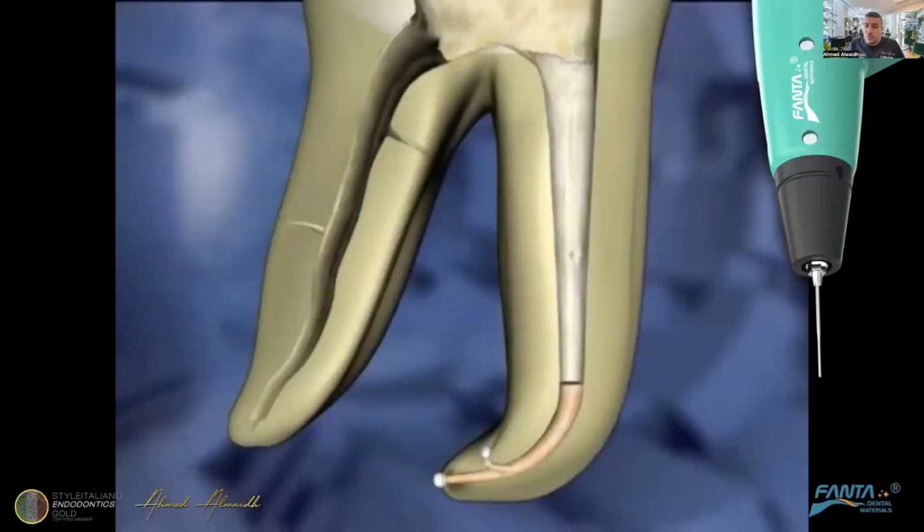Now, how are we going to use this one? Again, we will finish the obturation. We're going to put the device, the tip. The tip should reach the level where we start. And we don't extrude gutta-percha. Why? Because the tip is hot. We need to heat that portion of gutta-percha, so when we put the gutta-percha, it can be one piece, not separated.